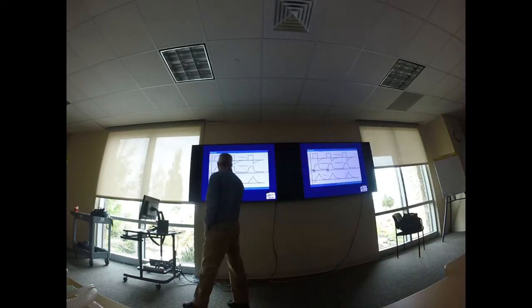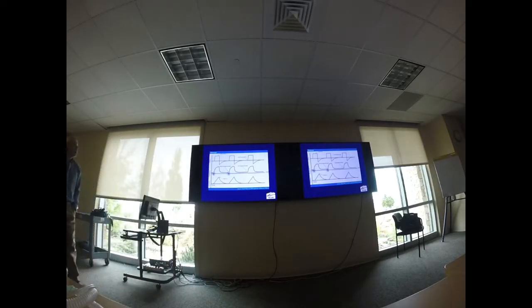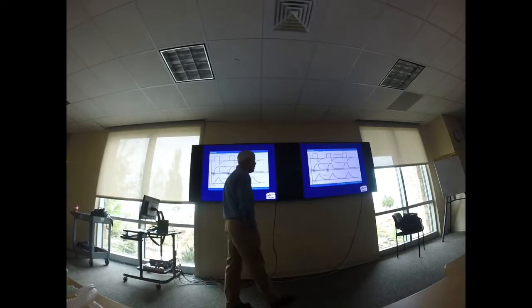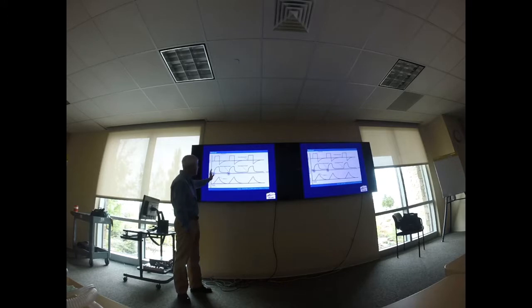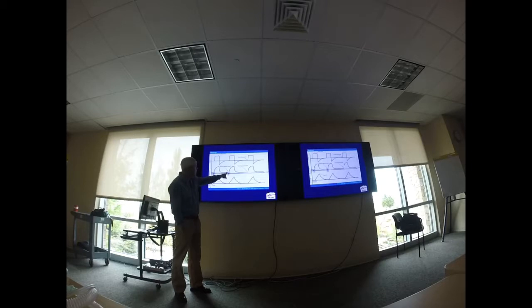So what we have here, you guys, is a picture, a graphic representation of somebody on assist control mode of ventilation, right? And so what I have done is I've set everything for them. I've set all the parameters for them. And so he's breathing, let's say 10, 11, and then let's say I've got the ventilatory rate set at 12. So let's say this is 11, this is 12, and he decides to take a 13th breath right here, okay? This is a patient triggered ventilation right here. You guys can see that, where the pressure changed a little bit right there.